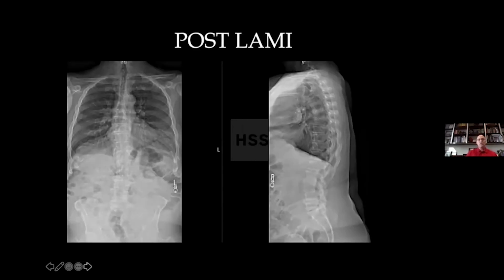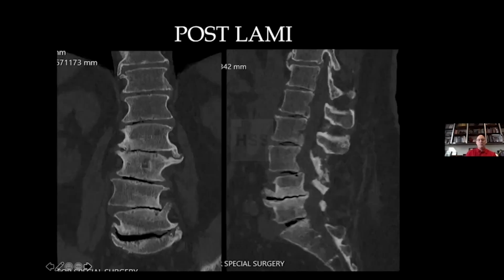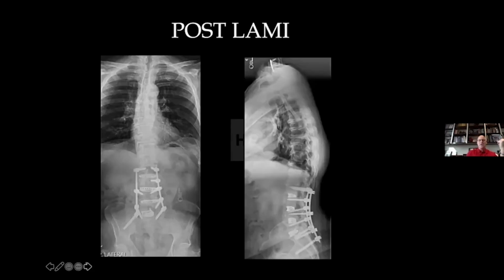And just to show that things can sometimes not go as perfectly as possible, this is one of the first cases we did with trying to do this. It may not have been a robotic case, but I can't remember actually. Chevy will correct me if I'm wrong. But this was a post-laminectomy guy that had such severe back pain, and you can see degeneration throughout his lumbar spine, stenosis, and we wanted to try and do him less invasively. He had problems trying to wean from narcotics, but here's what we did.